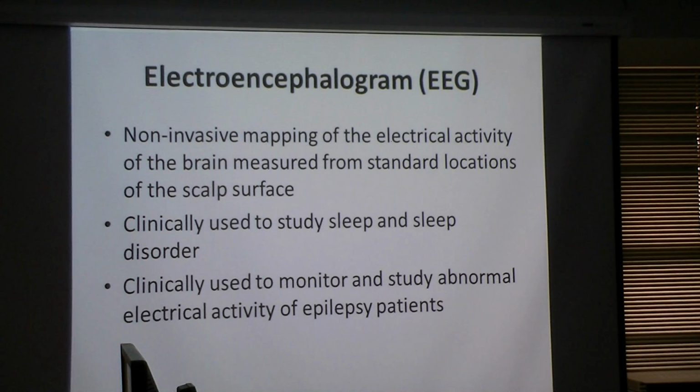Basically, EEG is used for clinical purposes for two things: to study sleep disorders, and particularly for epilepsy patients. If you know epilepsy, the brain starts working in some weird way and the person faints. So EEG is particularly used for these two disorders.